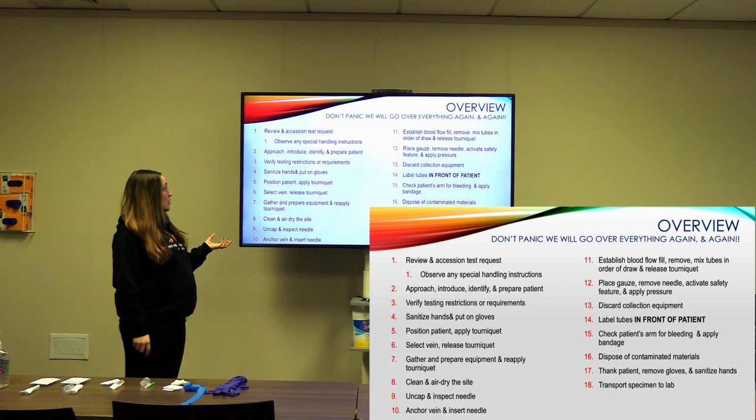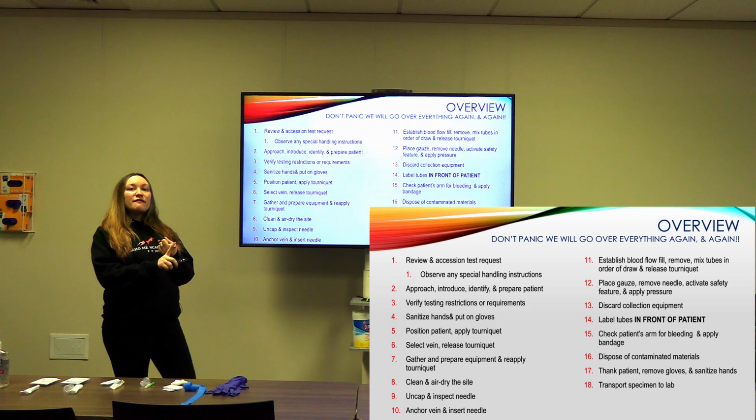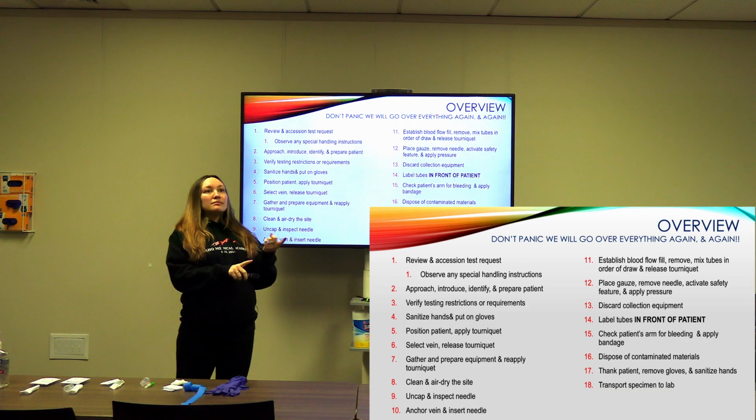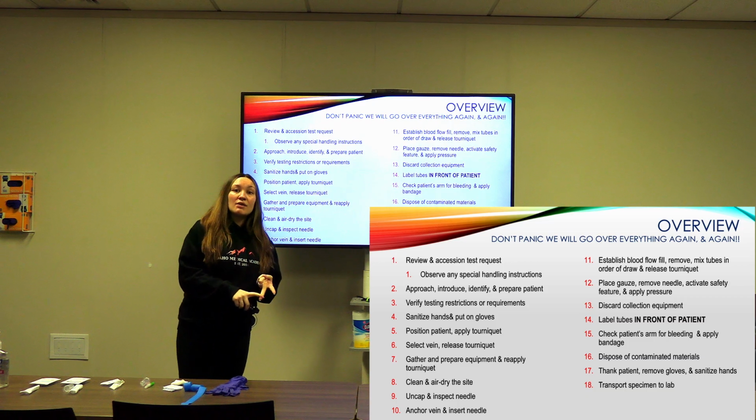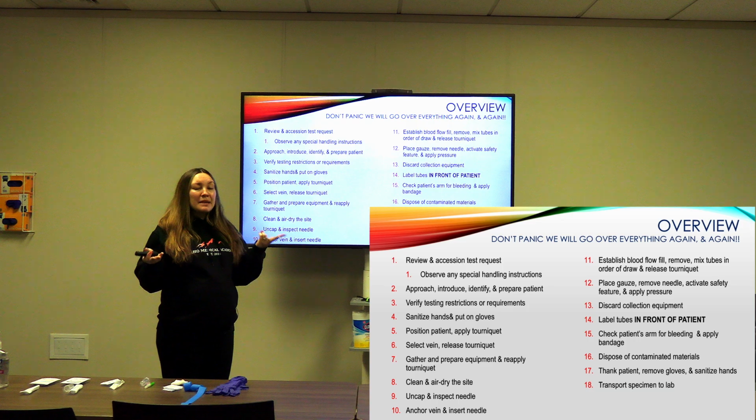Verify any testing restrictions or requirements. Does the patient need to be fasting? Does the patient need to have been resting, right? They can't just have gotten back from physical therapy, stuff like that.